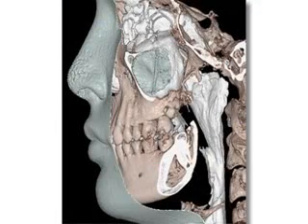And also, Dr. Miles, it appears likely that a dentist using cone beam CT would also see other pathology. Can you expand on that a little bit? Right. The other day, I came up with the concept of what's discoverable and what's referable. And they are going to see things in those anatomic planes of section that they need to refer. In the paranasal sinuses, in the airway, sometimes even in the cranial vault. So there are resources, again, out there that they can go to, to help them discover when they need to refer.